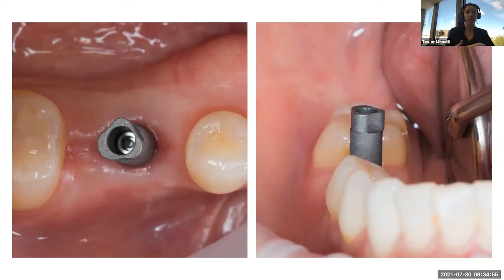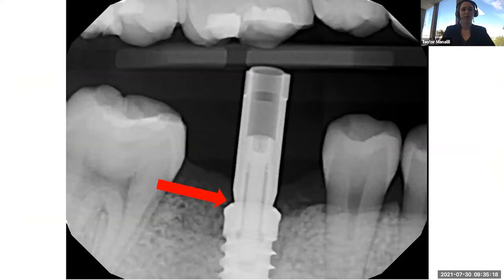It has a nice roughened surface, so it's pretty easy to scan. Because it's a single length, it does stick above the occlusal table, which you can see really easily here. Another reason is that once I seat it, I really love to do my prep scan and my arch scan right off the bat.